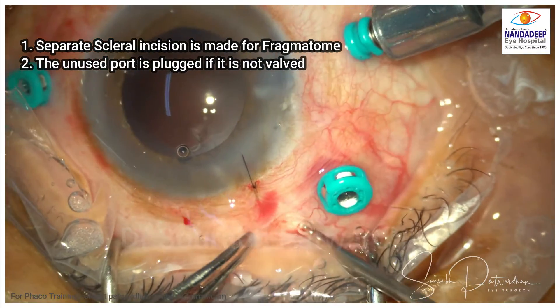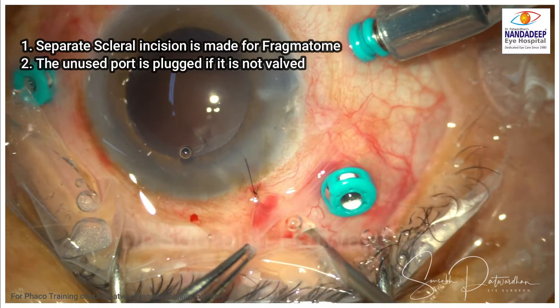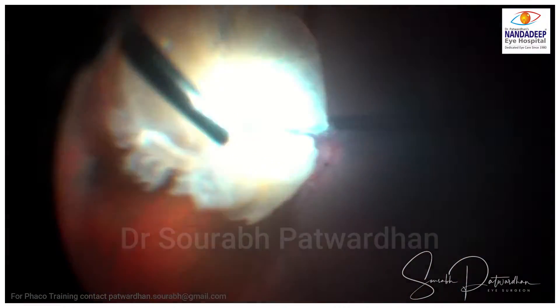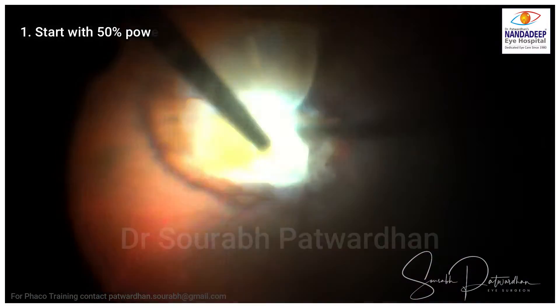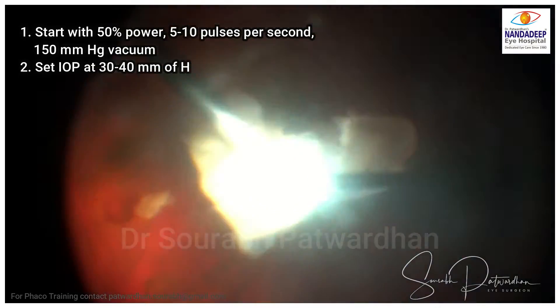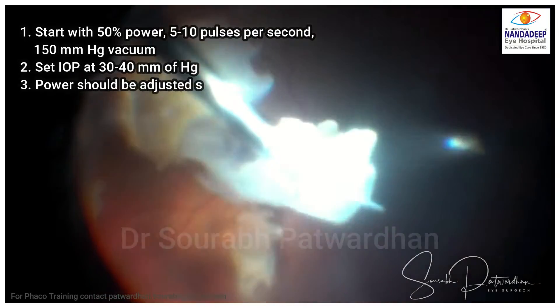A separate scleral incision is made for the fragmentome. If the ports are non-valved, you can close them with plugs. Always start with 50% power, 5 to 10 pulses per second, and 150 mmHg of vacuum.